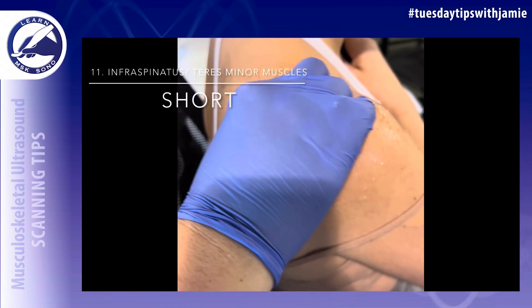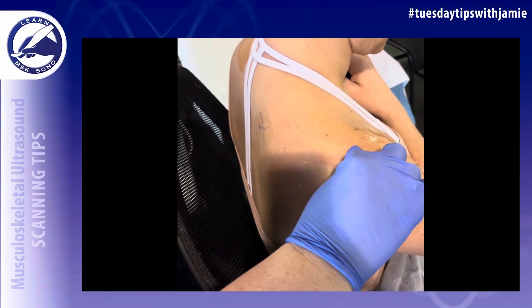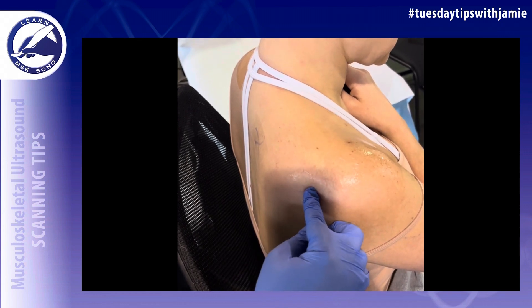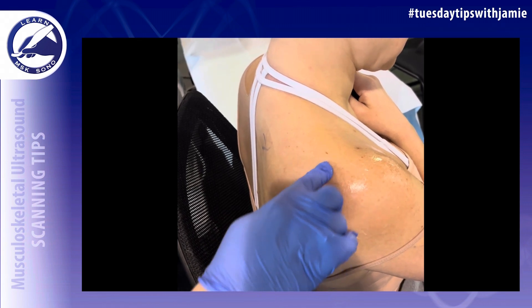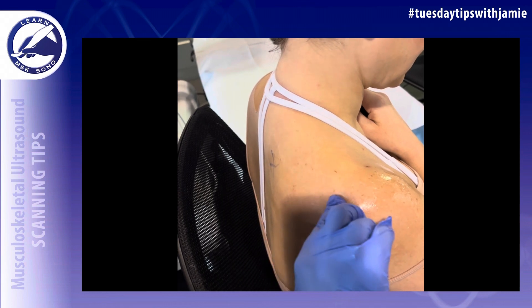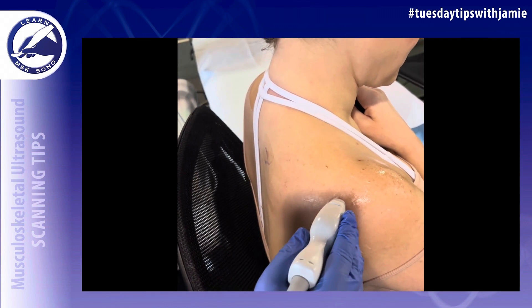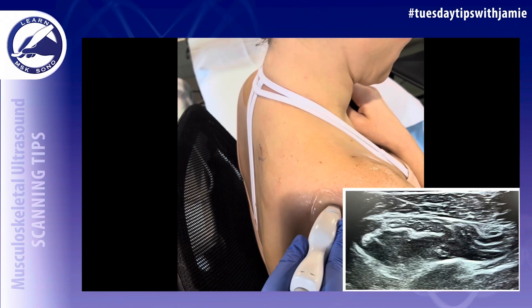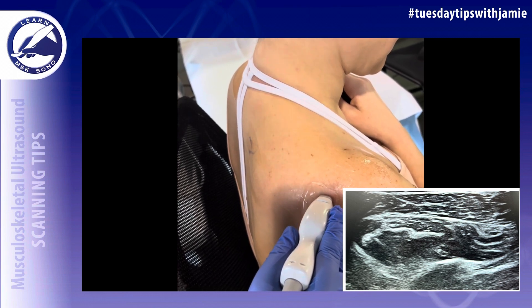Use the scapular spine as a landmark to image the rotator cuff muscles. Just below the scapular spine is the infraspinatus muscle, below that is the teres minor, and over the scapular spine is the supraspinatus muscle. The muscle fibers run transversely, so when you place the transducer sagittal on the patient's body you are actually short axis to the muscles, which makes it easier to differentiate the infraspinatus from the teres minor.